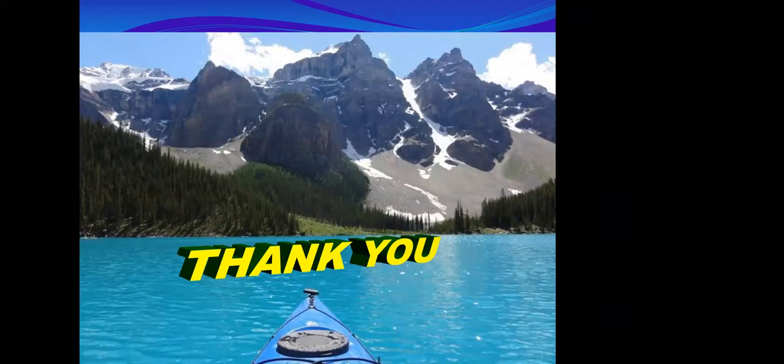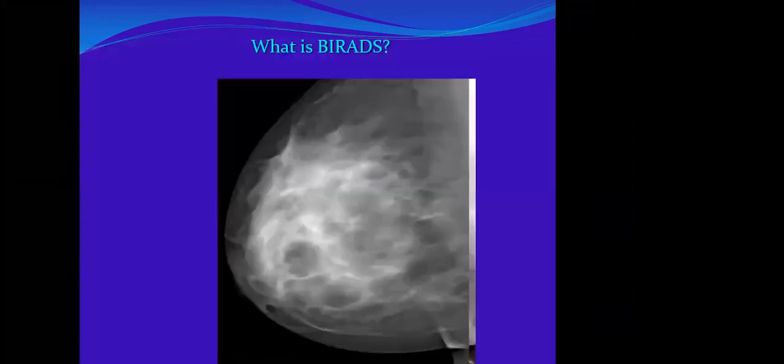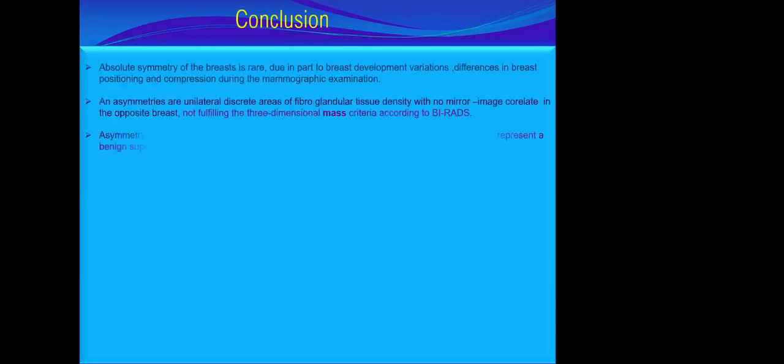I am Heidi. Regarding the slide before the conclusion, could it be a complicated cyst on ultrasound? This one? No, this is soft tissue. It is a soft tissue, and it was a biopsy-proven fibroadenoma. Oh, okay, thank you.